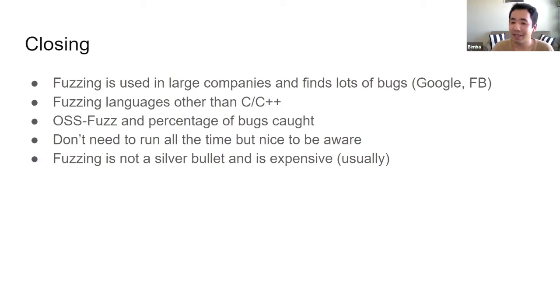And the next step after that would be to just run fuzzers for a little while on some simple, easy to black box API functions. And you don't have to run it on a cluster. You can just run it on your machine for a couple of hours, or put it into some CI pipeline that runs it for a little while. It doesn't have to be terribly expensive to be effective.